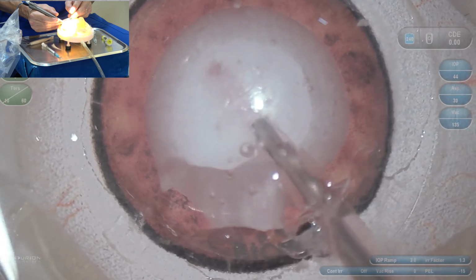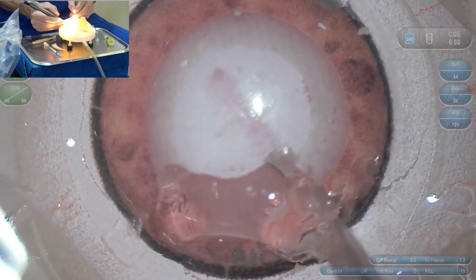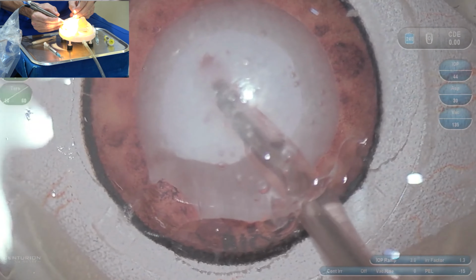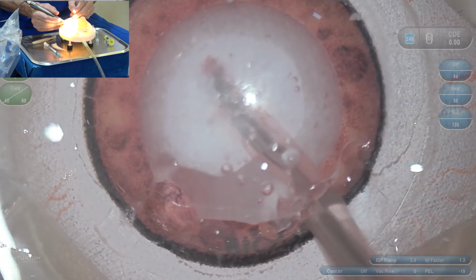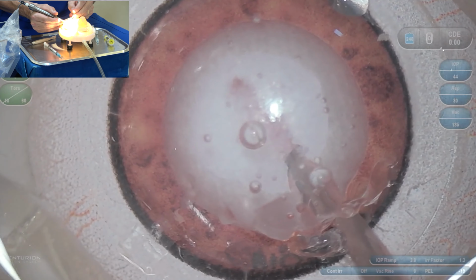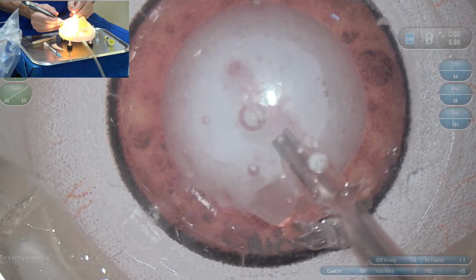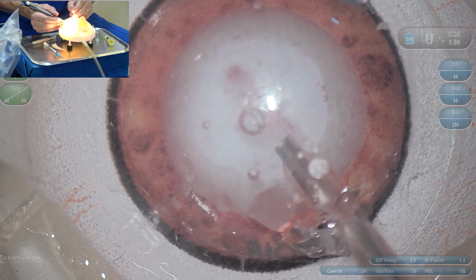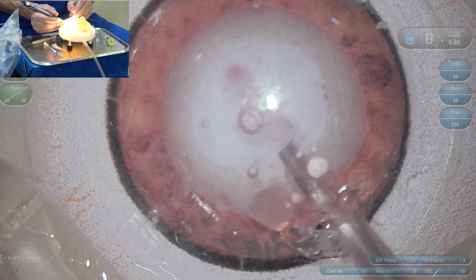I go to quadrant removal, and remember, this is going to be very important. Phacodynamics is not only about the parameters you have, but how you deliver the ultrasound. So I'm in the safety zone in the center of the eye, and I'm doing position 2 and position 3 to allow vacuum and the aspiration flow to do all the job.